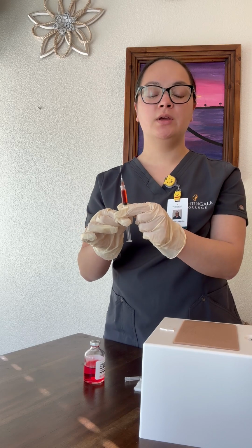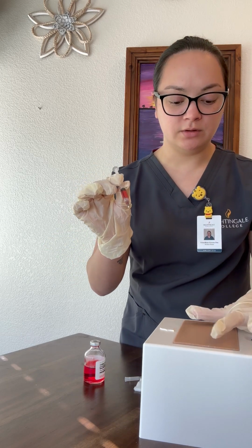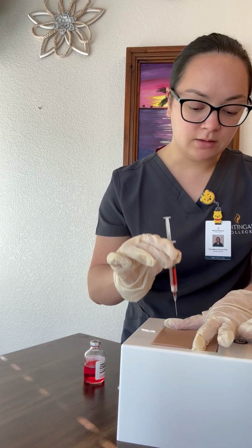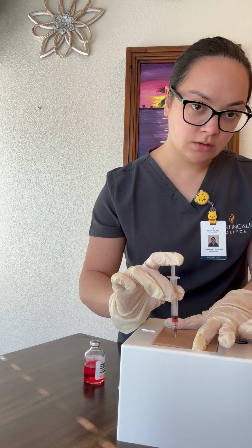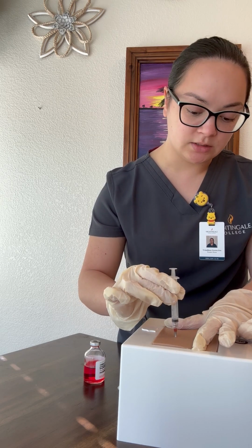Okay, so we'll hold it like a dart. Here's our site. We'll go ahead and pinch slightly and pierce and inject. Okay, and we will also hold this here for 10 more seconds.